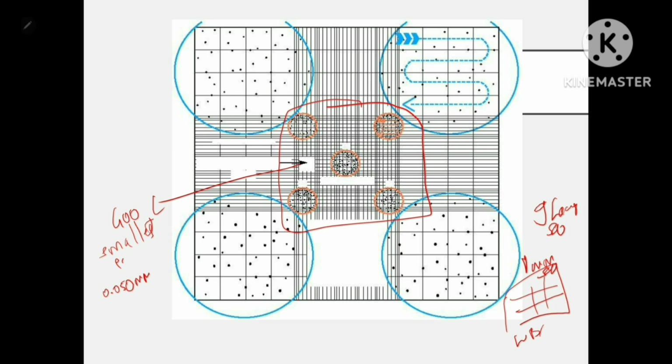Because of the concentration and size of the RBCs and WBCs, the central area is ideal for RBCs. This is where we count RBCs. The WBCs are usually lower in concentration, which is why we usually count them in the corners.